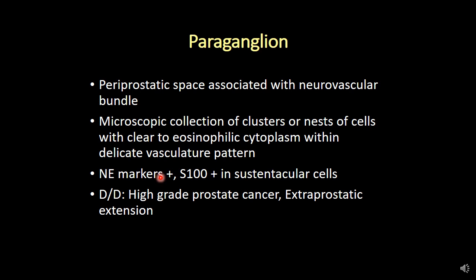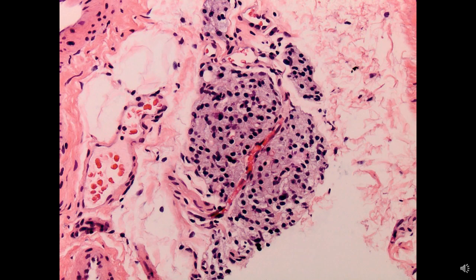The typical differential diagnosis to avoid is high grade prostate cancer and extraprostatic extension. Here is a nice example in needle biopsy — you see a collection of these cells in a delicate vascular pattern within fat space, very easy to over-interpret as extraprostatic extension and high grade prostate cancer.